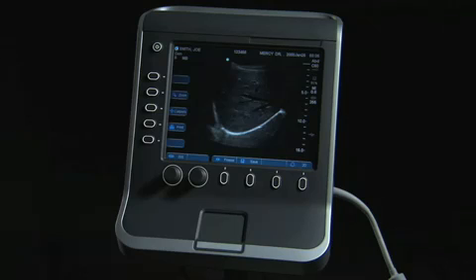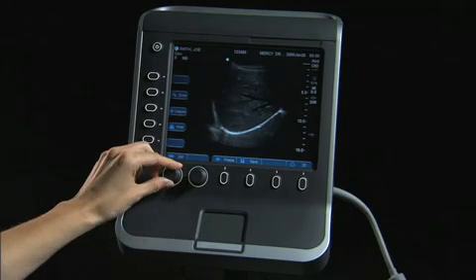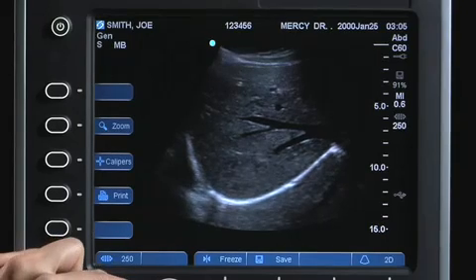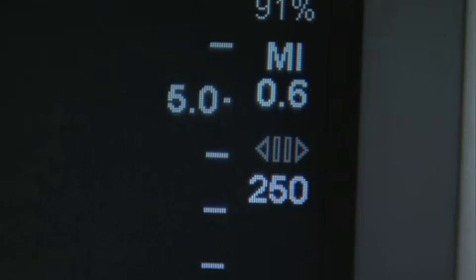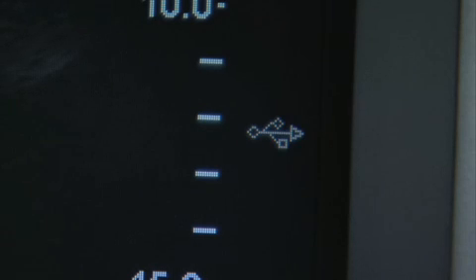When the image is frozen, you can select a frame by scrolling with the gain knob. This number indicates the frame displayed. If a USB memory stick is in use, a USB icon will be displayed to indicate it is active.